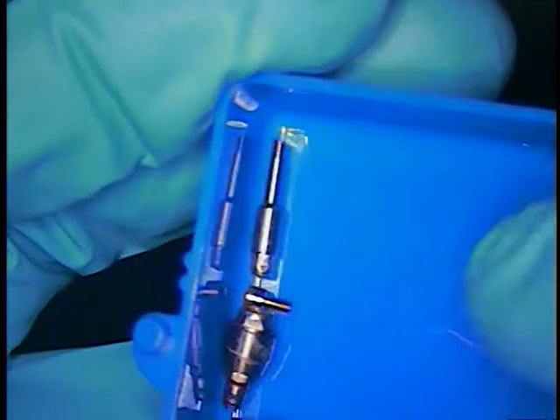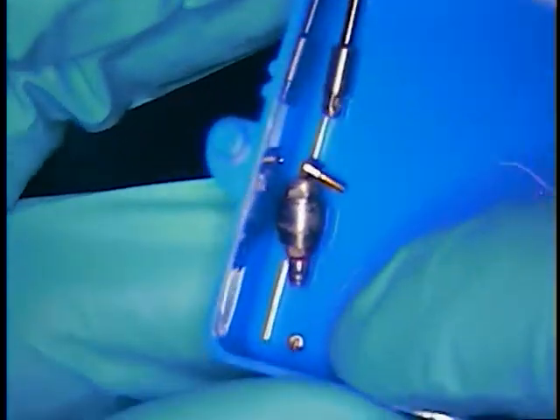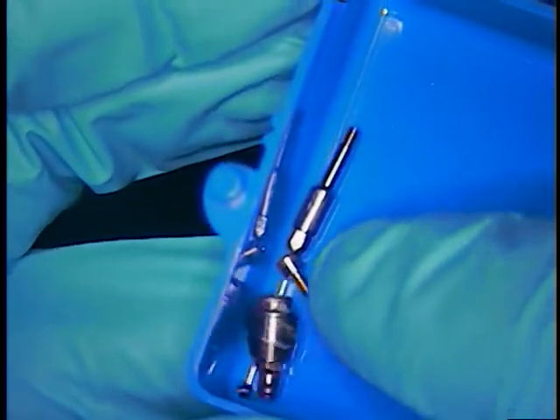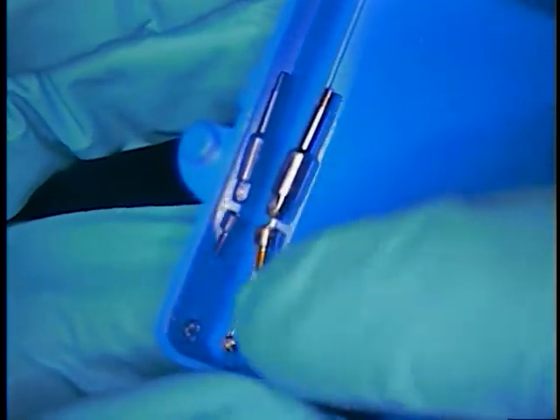And I'll show you them again. This is the sequence. We were able to get the abutment out, and finally the little piece that's fractured that goes into this piece, and the prosthetic screw on top. So there's 1, 2, 3, 4, 5 pieces total. In they go in a little box, safekeeping.